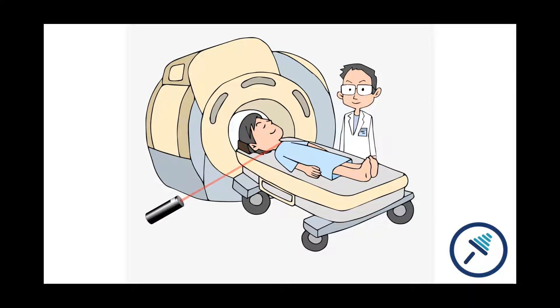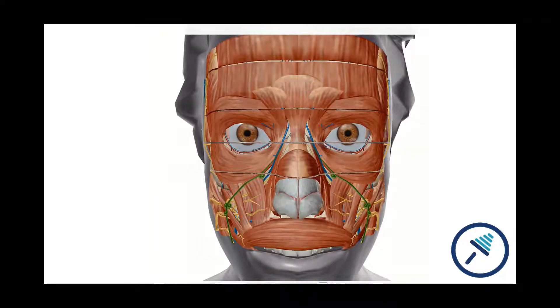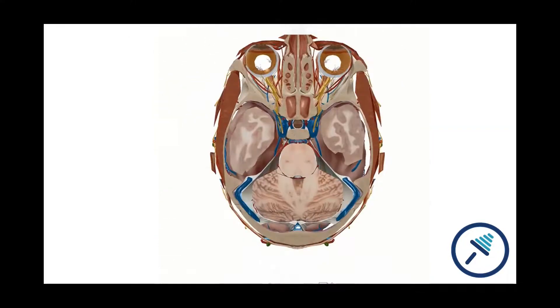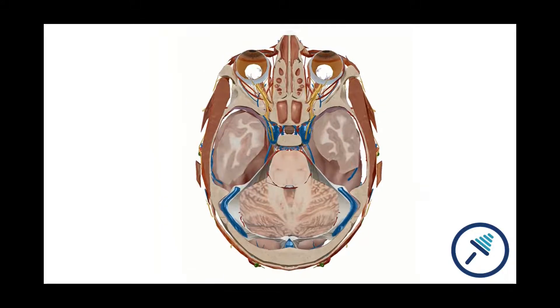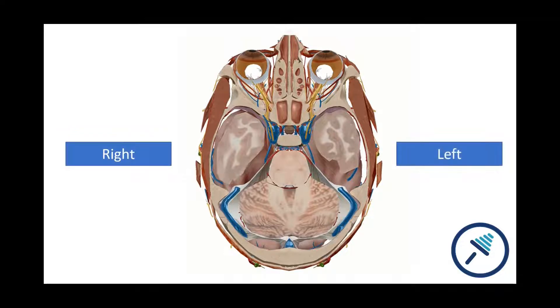And when you see the images of a CT scan, it will be like that. Like this slice that you can see right now. And we can conclude that this is right and this is left.